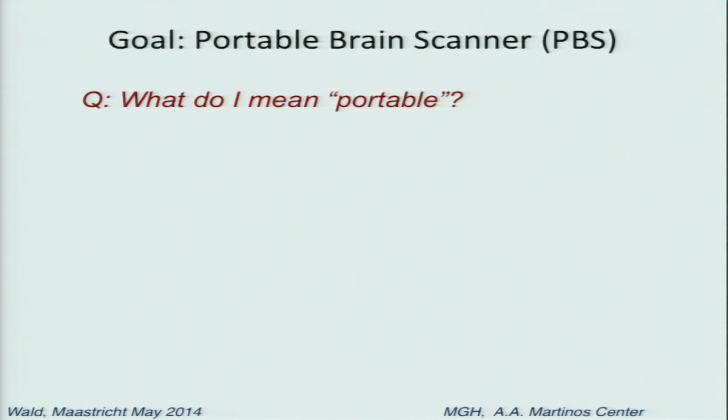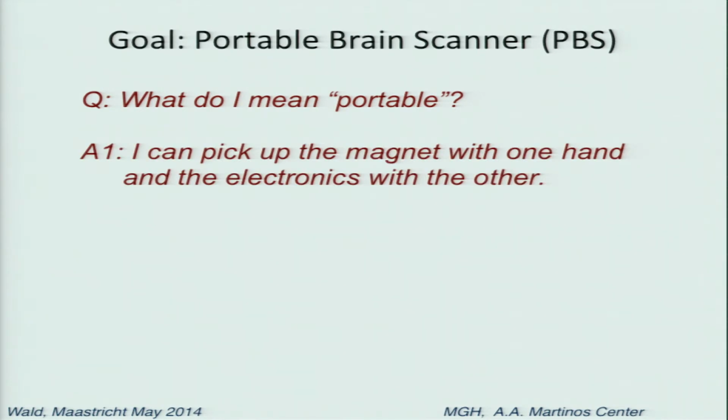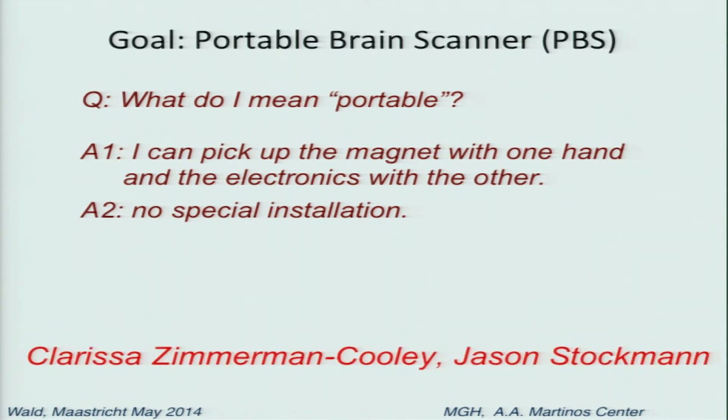Of course, if CT can do it, then MR should be able to do it better. But by portable, it's really tough, because I really want it so that I can pick up the magnet with one hand and the electronics with the other and carry it across the room. And that you have no special installation requirements, no power, no cryogens, no venting, no shielded room, no ferrous exclusion zone. So this is something Clarissa Zimmerman and Jason Stockman in my lab have been working on.